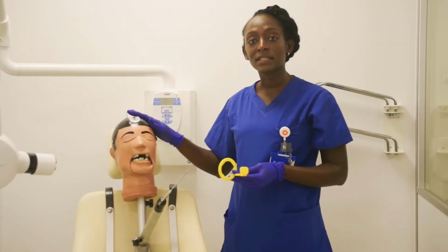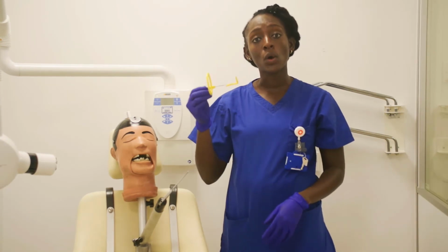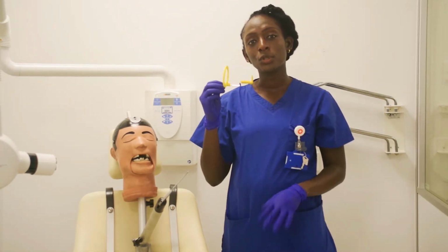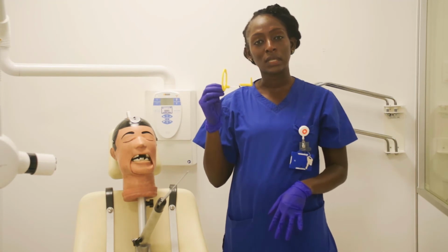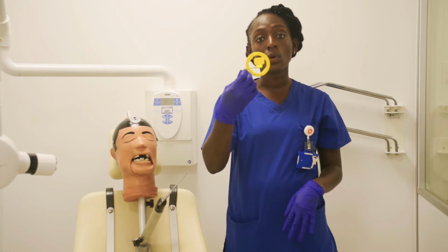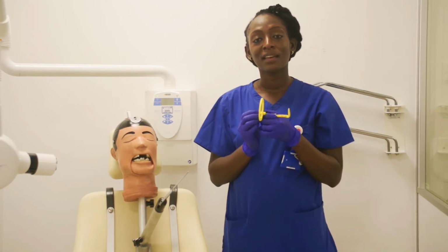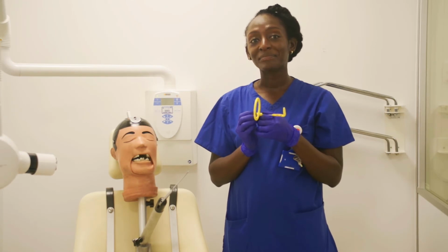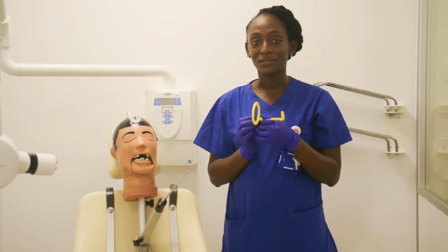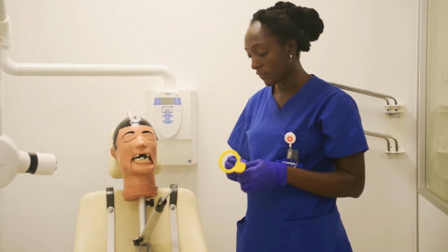Okay, so this is Dexter. We're going to take a posterior periapical on Dexter. I've already got my holder set up. So now I want you to pause the video and think about it for a second. What is this setup for? Is it for the upper left or upper right? So think about it. So I think you all got it. It's set up for the upper left. So we're going to take the upper left 6 of Dexter.